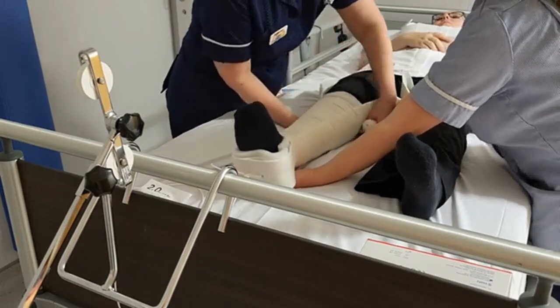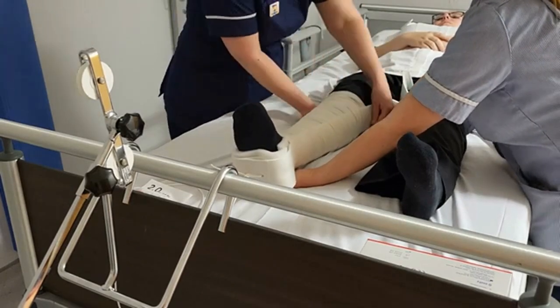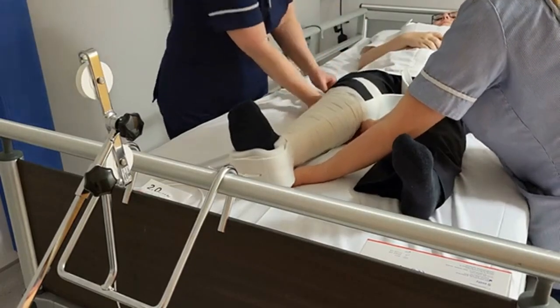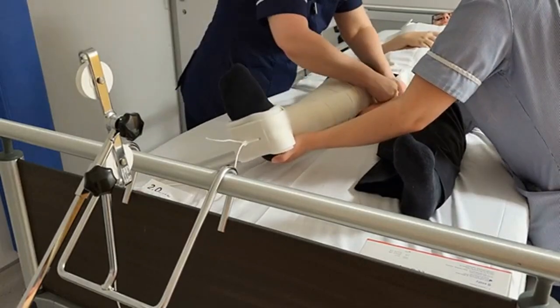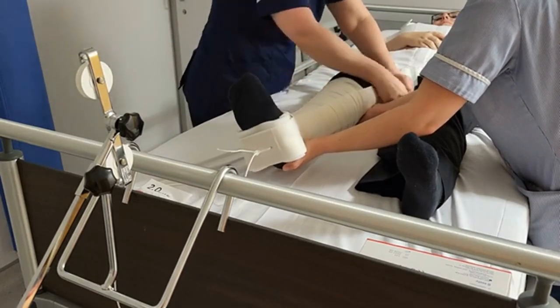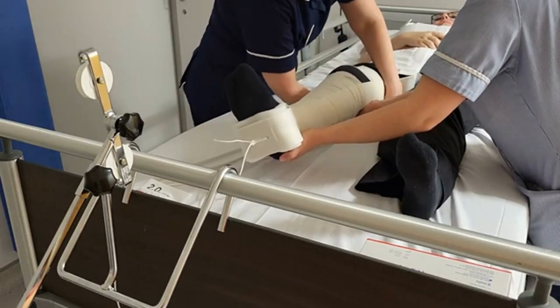When we get to the back of the knee, we need to leave a gap so as not to compress the main artery that runs there. We don't want to cut off the circulation, so leave a little gap around the knee. We're still supporting the leg and still maintaining the pulling traction at the ankle to ensure the patient is as comfortable as possible.